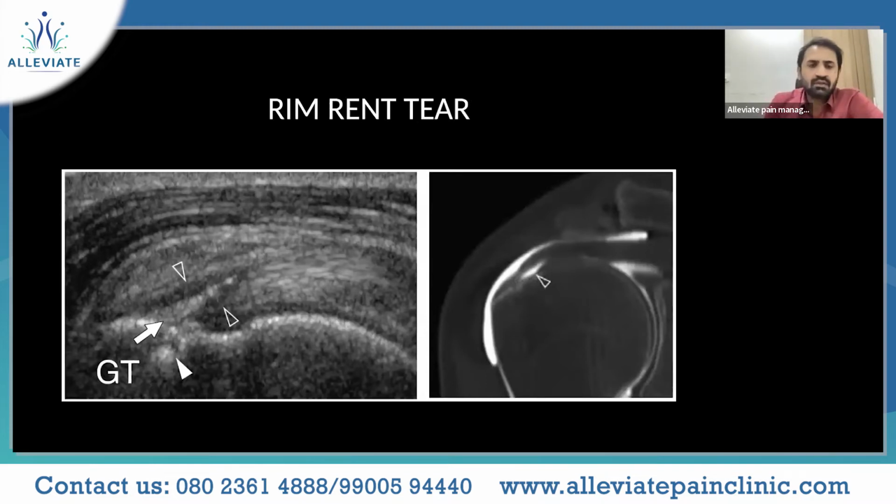It looks as though this is a calcification, but this is basically a few articular fibers getting detached, where there is a hypoechoic area with a hyperechoic central area. So this should not be confused with a calcification.